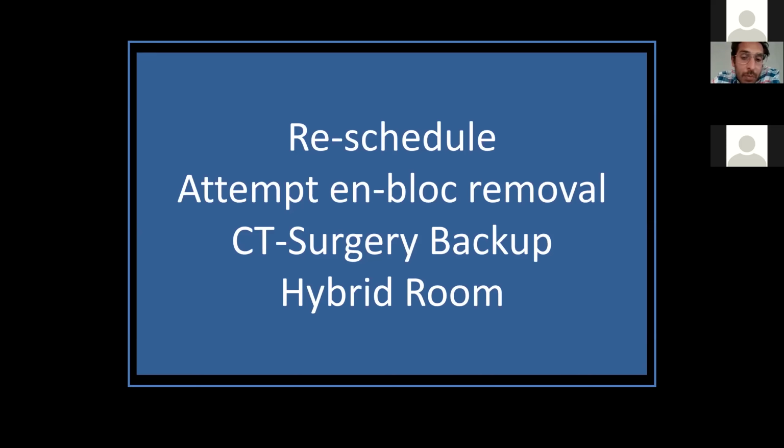I had them on backup, and we did this in an OR setting in the event that they needed to have a thoracotomy. So another question. The question is, have you put cleaner through Cat 8 or Cat 12? I have not put it through Cat 8 or Cat 12. I don't think the device is long enough.